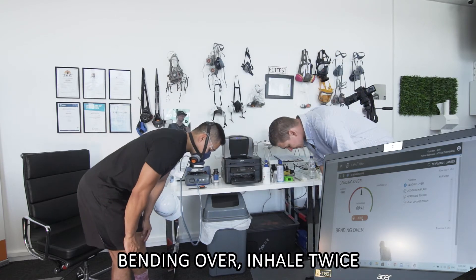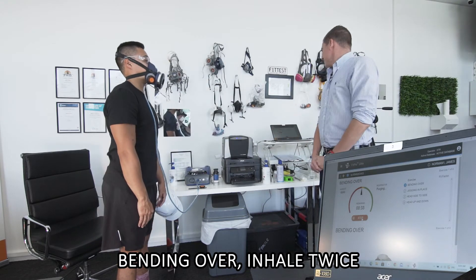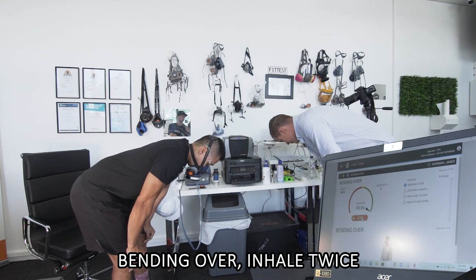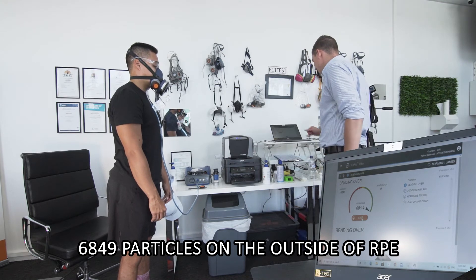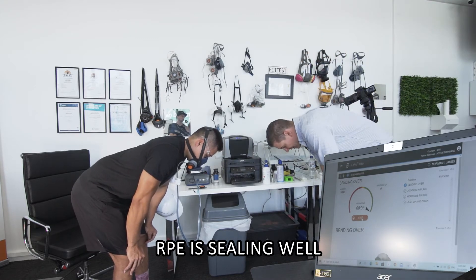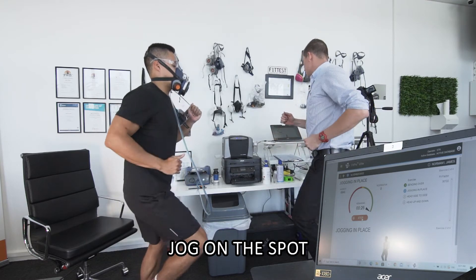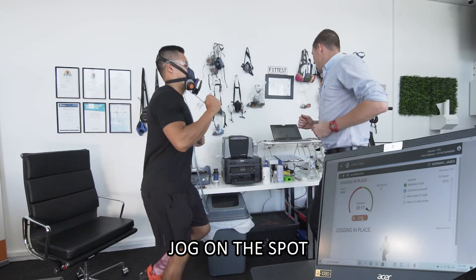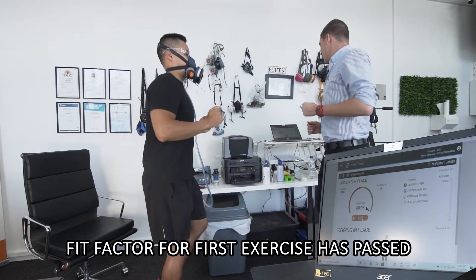Two breaths, and then all the way down — two breaths — and just pause. And back up again. All the way down and pause. I'm just going to run you through what's happening — basically we're sampling air on the outside of the mask and the air on the inside. At the moment there are 6,849 particles on the outside, and on the inside of the respirator you have zero particles getting in. So the respirator is actually sealing really well on your face. You're doing really well with those exercises — keep going, all the way down, two breaths and pause. And back up again.